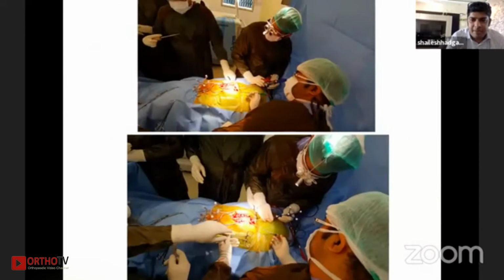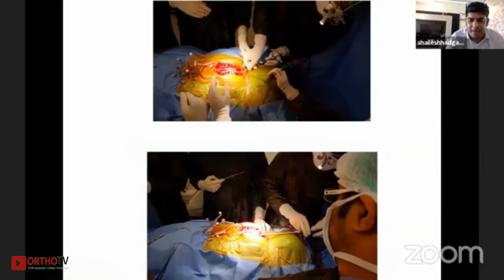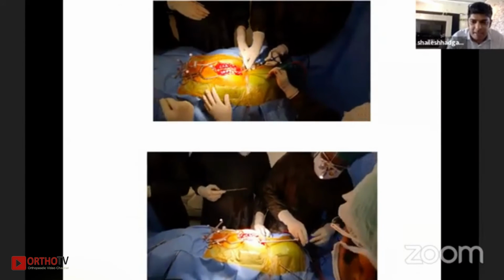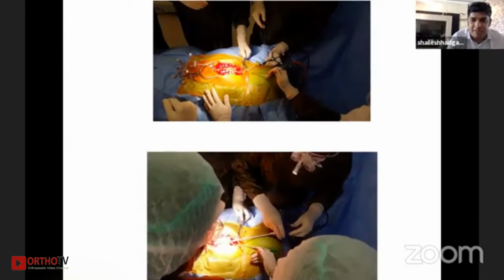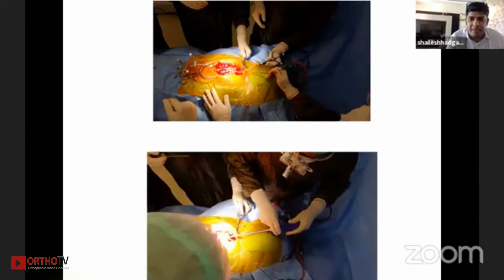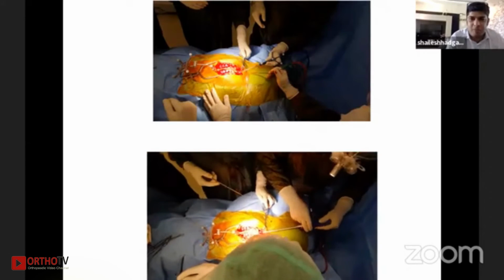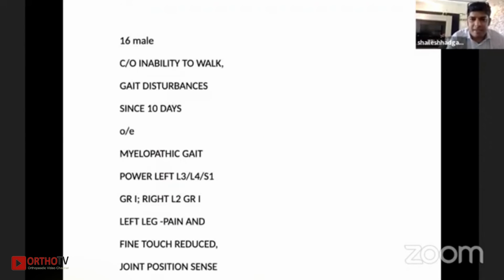So all these are big advantages for spine for sure, because you are really worried. If you see, I'm putting the screw and I'm exactly parallel to the ground, but I'm very comfortably doing it with very less stress. Otherwise, there used to be a lot of panic moments, whether there is a breach going towards the medial side, the cord, I'm not too sure. So all these things are a big advantage.